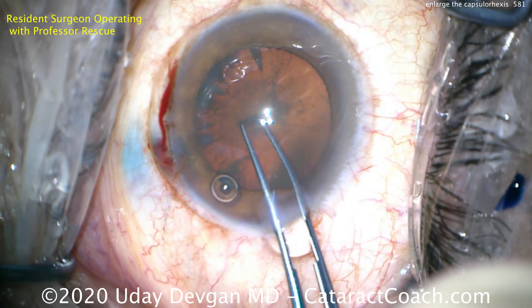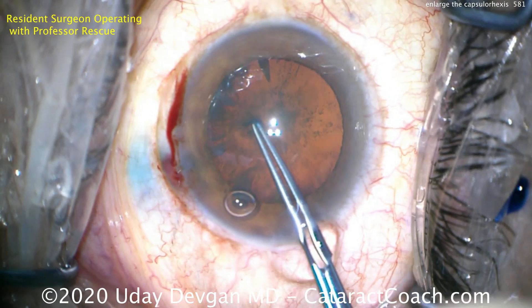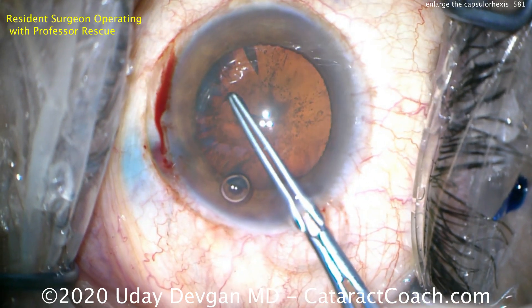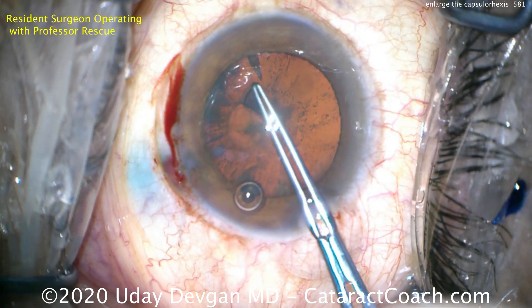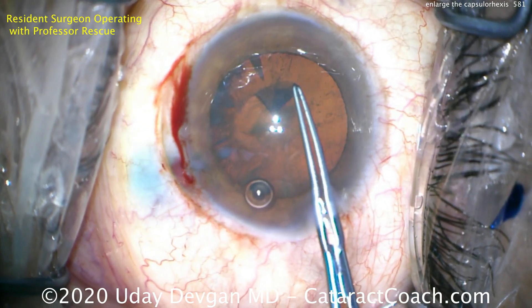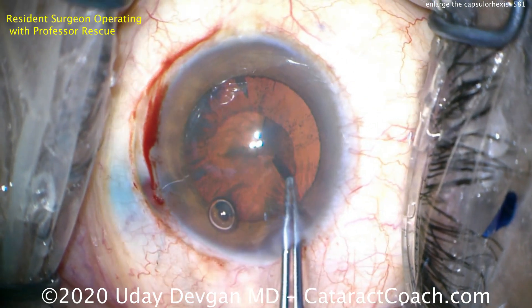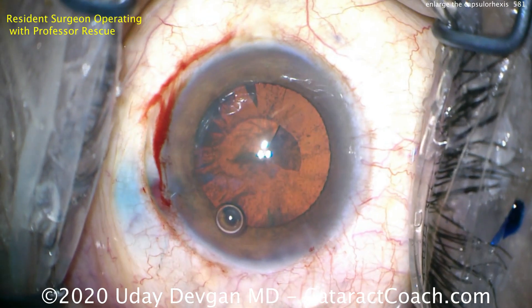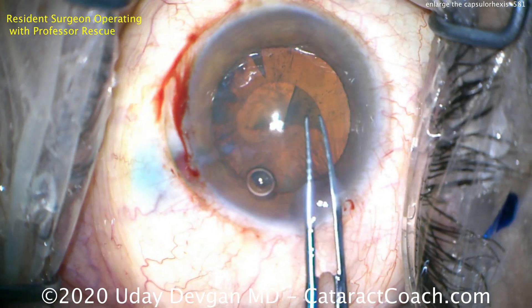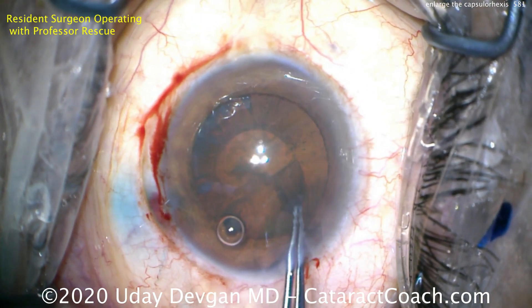The resident is starting the capsulorrhexis, and it's going to end up being a small one. With a little poking on the forceps and a small tear here — the capsule has been stained with trypan blue dye for better visualization — the resident is being very shy, too timid, and making a very tiny capsular opening. This is a common problem among young residents who are just not quite confident enough.